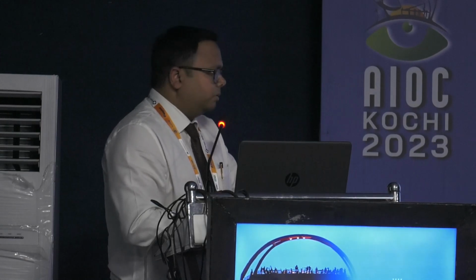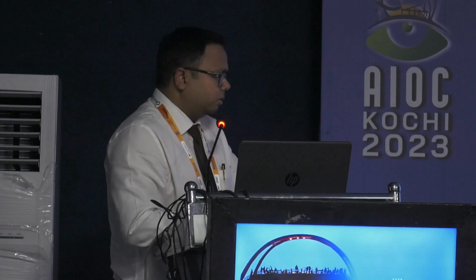But if you look at most of the published studies, and even at your cases, the majority of patients have an astigmatism of about -1, -1.5. A very fortunate patient might end up with astigmatism of 0.5 or so. But some amount of astigmatism is always there. Regarding the placement of the IOL, to quote our teacher, Dr. Pramod Bende sir, a 7-degree tilt of the IOL is acceptable in the case of SF IOLs. That is something one has to keep in mind.